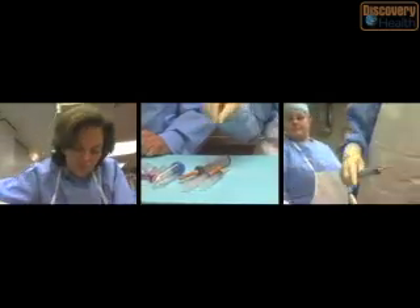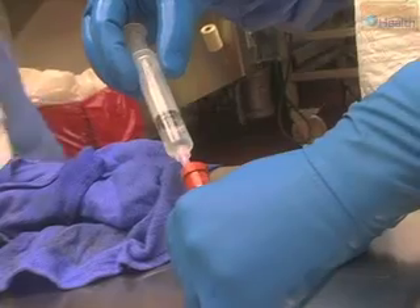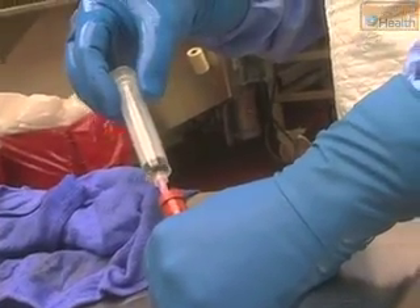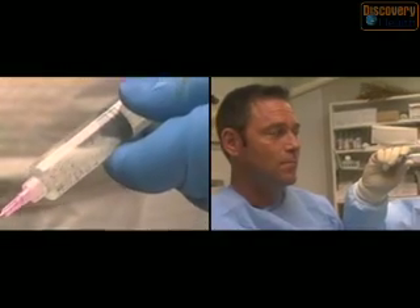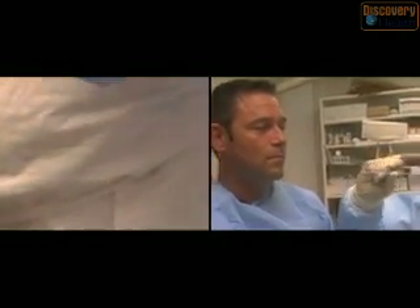Some of the tools are highly specialized, such as the different types of hypodermic syringes used for collecting body fluid for toxicological tests. We put the needle in the white part of the eye, inside the eyeball where there's the fluid, and then draw it out.